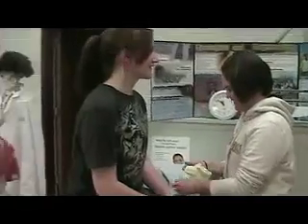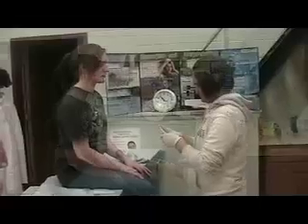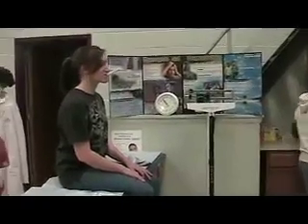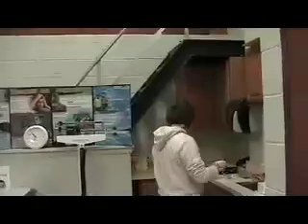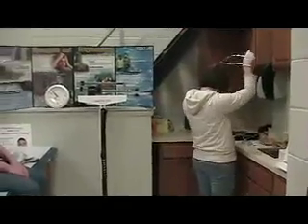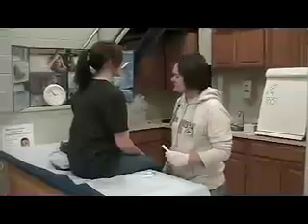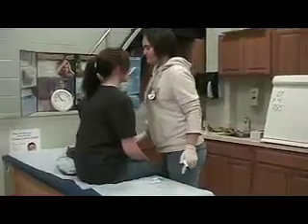Oh, hello! I'm Danielle. I'm going to be your nurse today. You're first. Hold this on your tongue until it beeps.